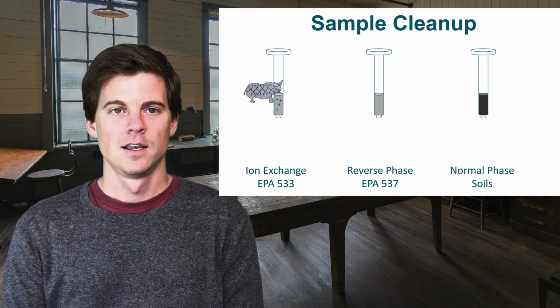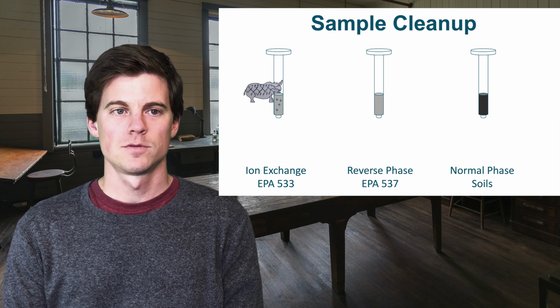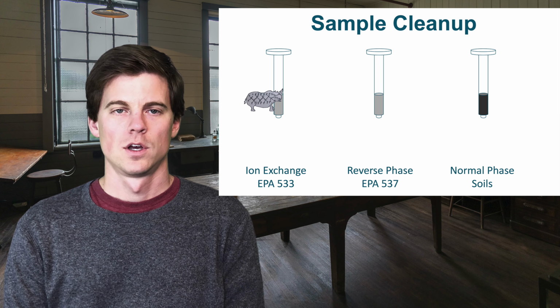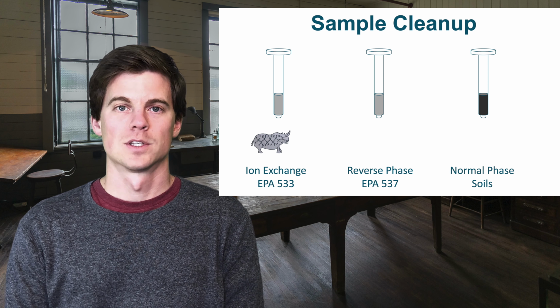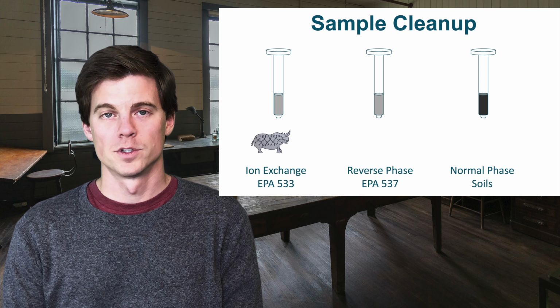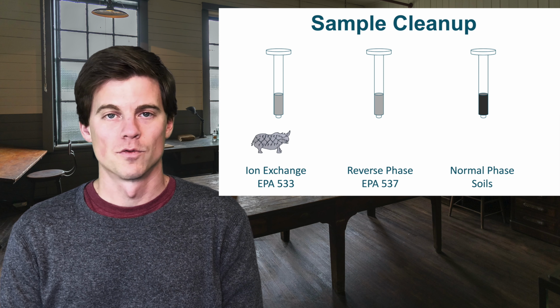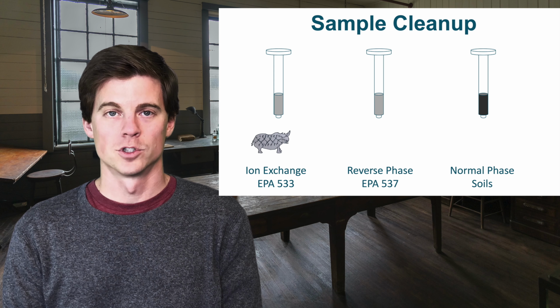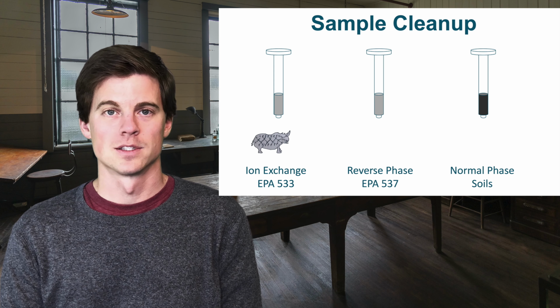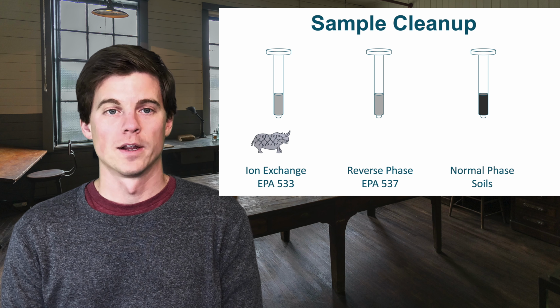That's handy. Then you can add a different kind of buffer or something to neutralize those positives. And then our PFAS, any acidic PFAS that is, such as PFOS, will come off of the tube, and you can collect it for further analysis. This is a good way to clean up, because you would hope that a lot of your junk that's in the samples is not acidic and would just flow right through.